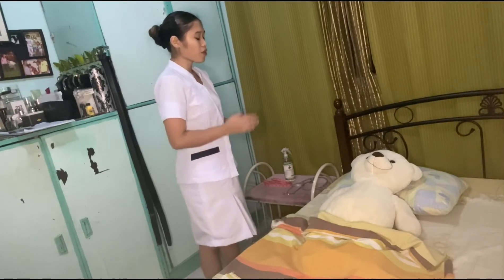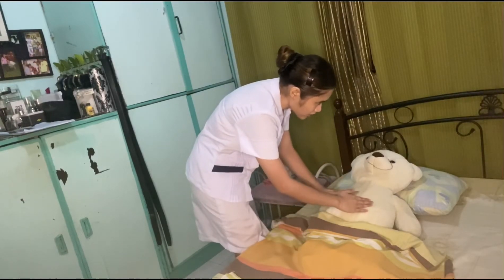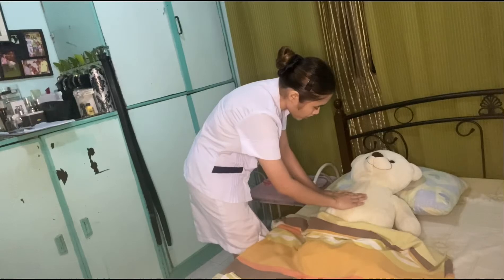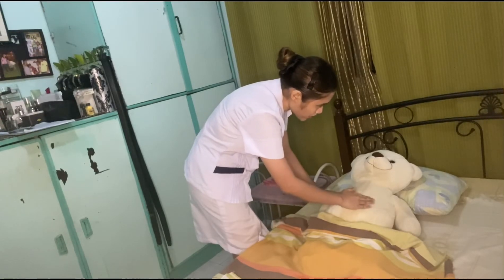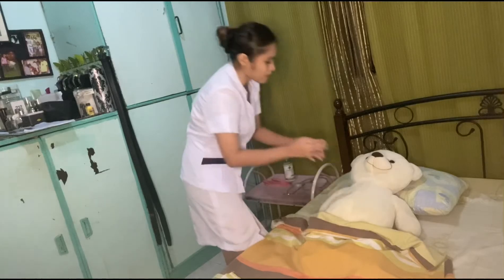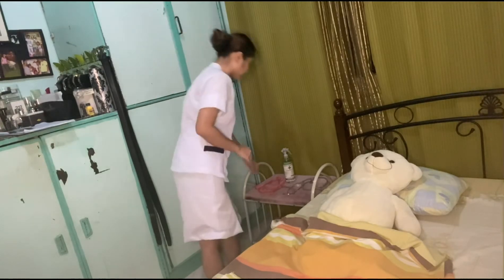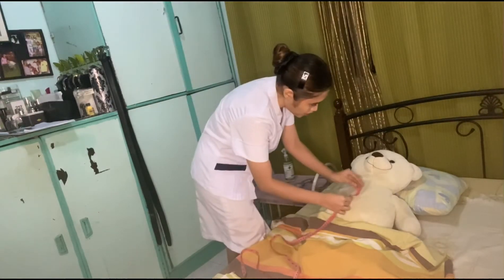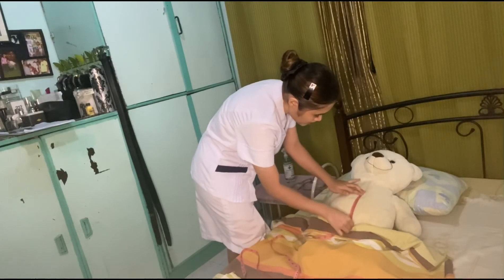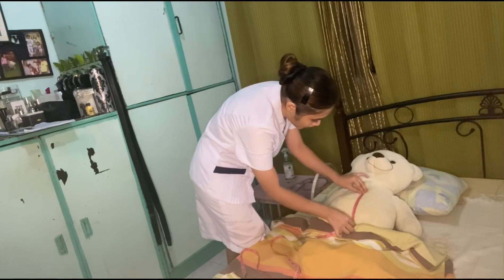Now I am going to warm my hands and touch your belly. We are going to palpate for the top of the fundus — this is the part because it feels like a hard ball. We will also assess the pubic bone — the top of the pubic bone — where we will start the measurement. I am going to take the tape measure, choose the centimeter side, and measure from the top of the pubic bone to the fundal crest. That measures about 28 centimeters, which means it is correlated to your AOG.